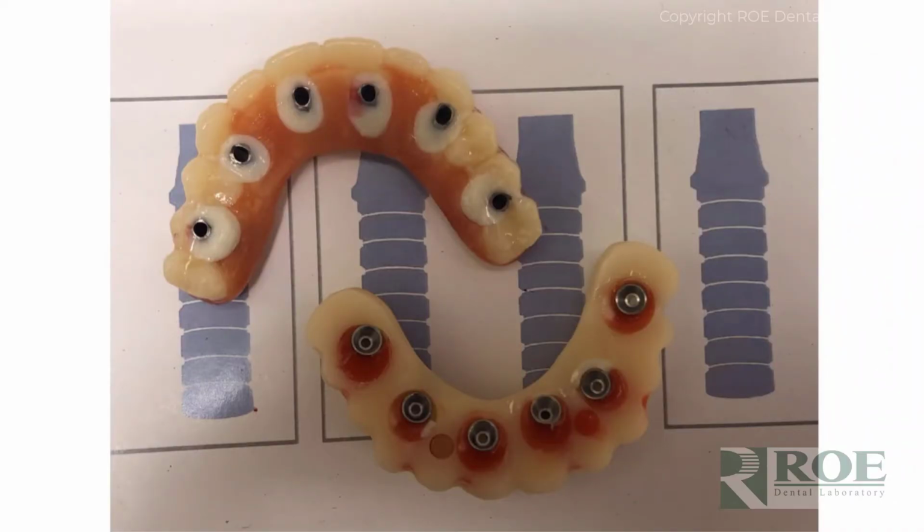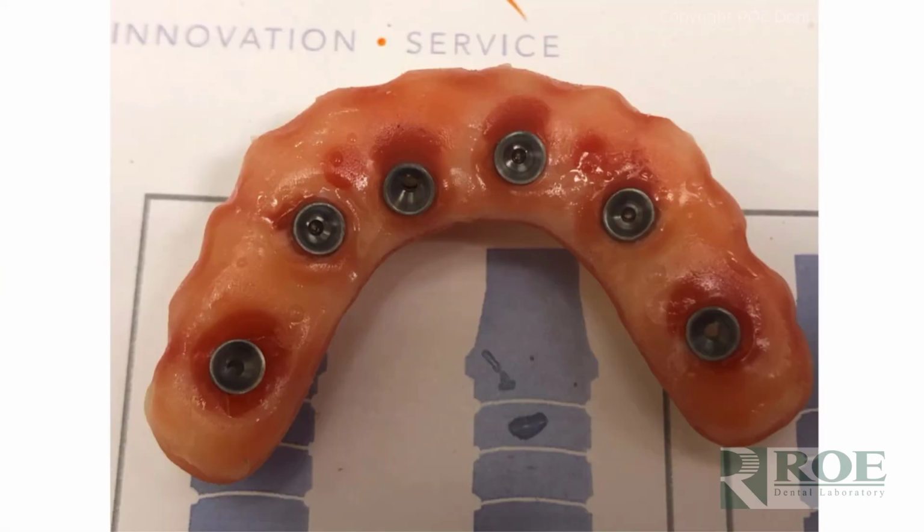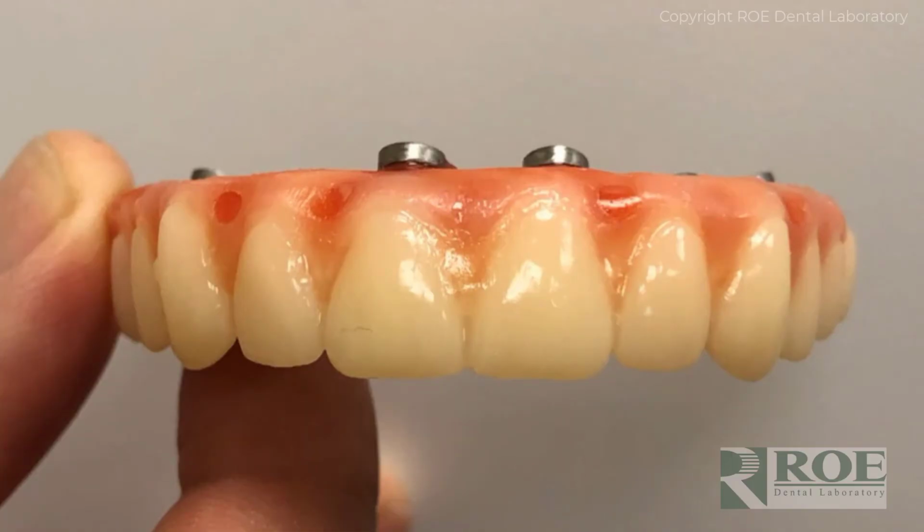This is what it looks like, occlusal intaglio. After it's been processed, probably need to fill the hole here. And so this will be adjusted until it's smooth. And then the occlusion will be refined once it's seated. Right, nice work.